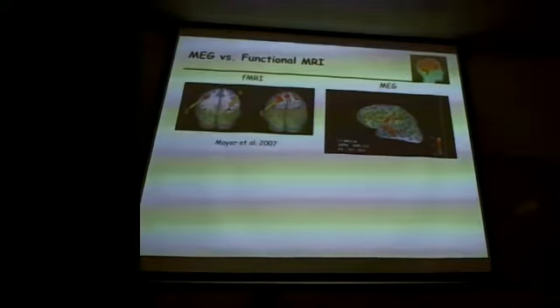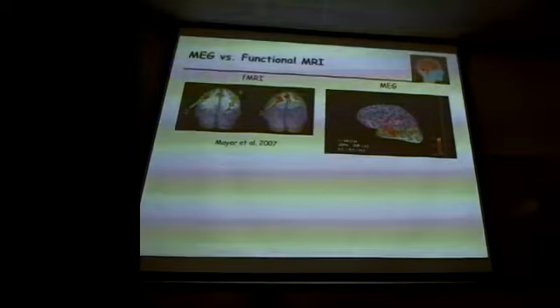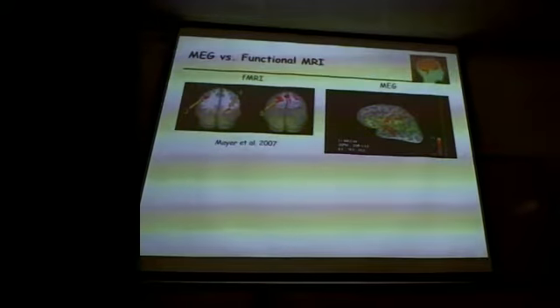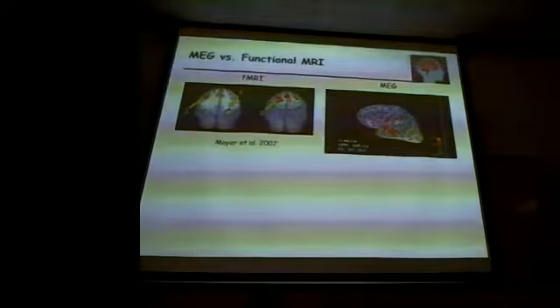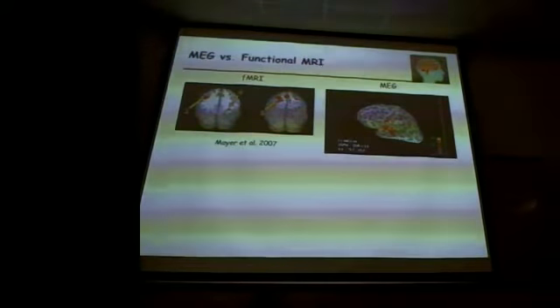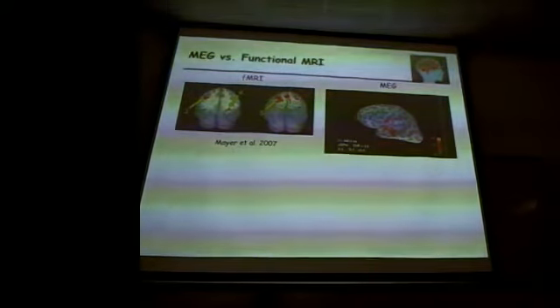This is a word stimulus. You're listening to words, and the auditory cortex is responding to those words. So again, with MEG, what we're looking at is the change in timing of this activity at a much finer temporal resolution. Can you see these changes without any stimulus?